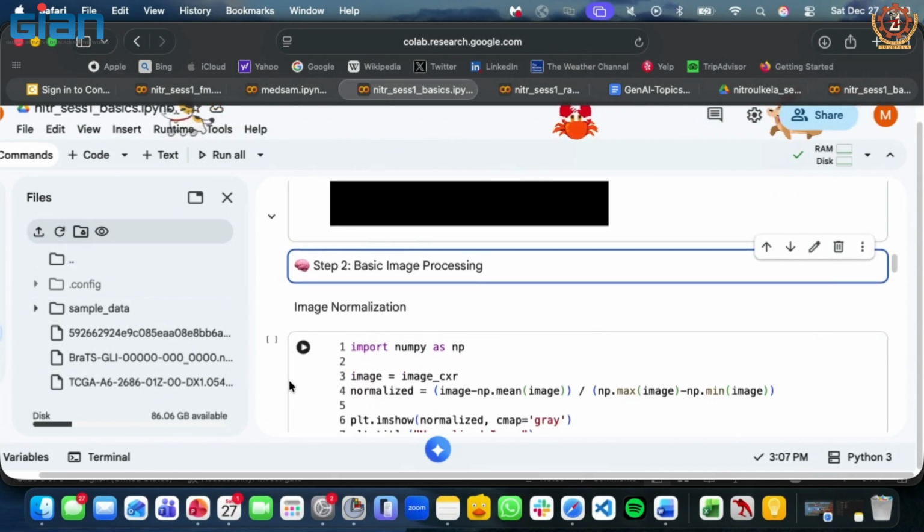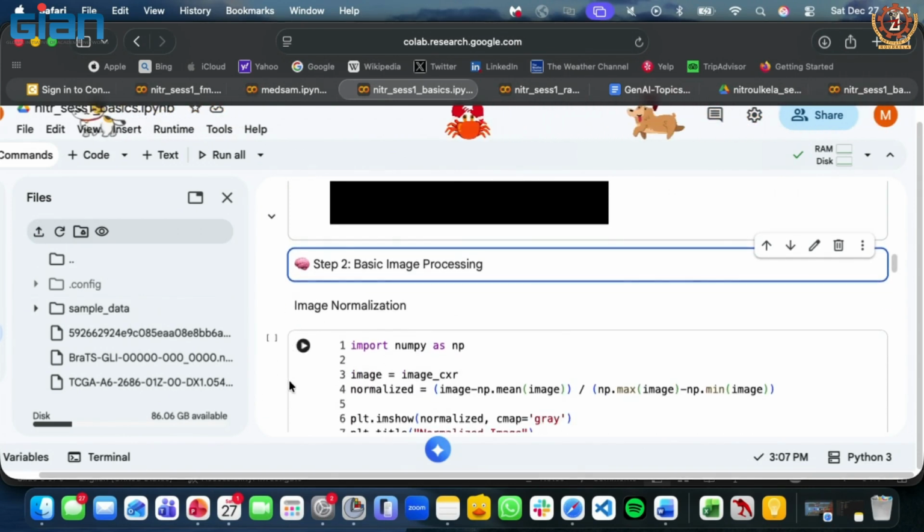Okay. Step 2 is basic image processing. Let's say I was talking about scanners. There is a scanner at NIT Rourkela, let's say in building A, acquiring images with 1 cross 1 cross 1 thickness, and there is another CT scanner at building B, acquiring CT scans with a slice thickness of, let's say, 1.5 cross 1.5 cross 1.5. Over 1 year you collected 1000 CTs each, and now you want to train a deep learning model with your own institution data. Would you combine this data and train?